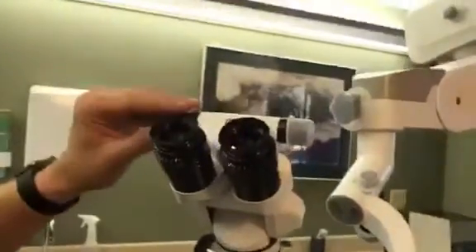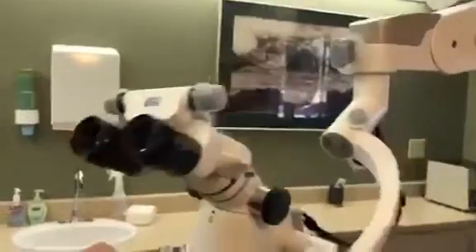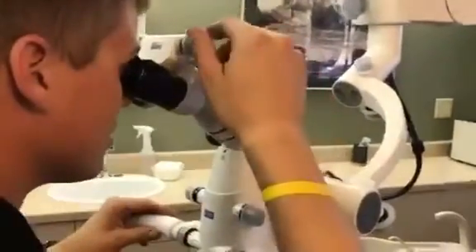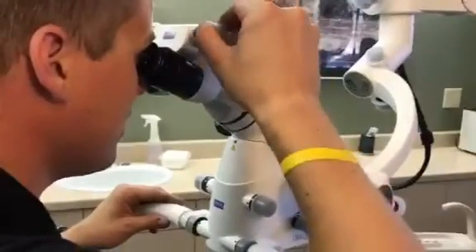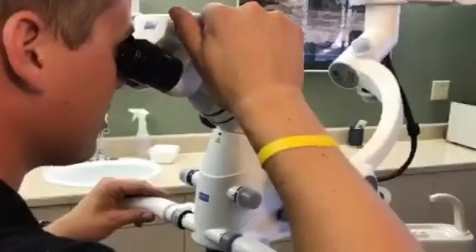When you're using the microscope, you also adjust your PD. So if you have a narrower face or wider face, go ahead and get your microscope. What you'll do is start wider, then narrow it down until you see one image — one circle, just like your loops.